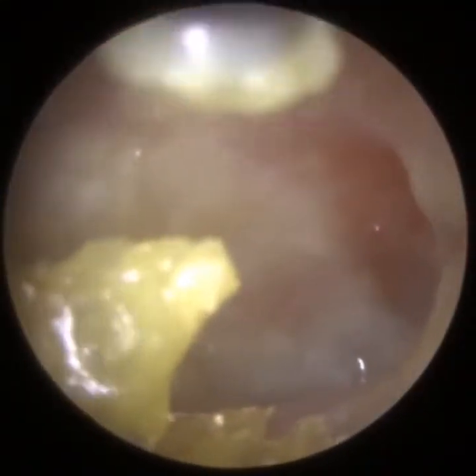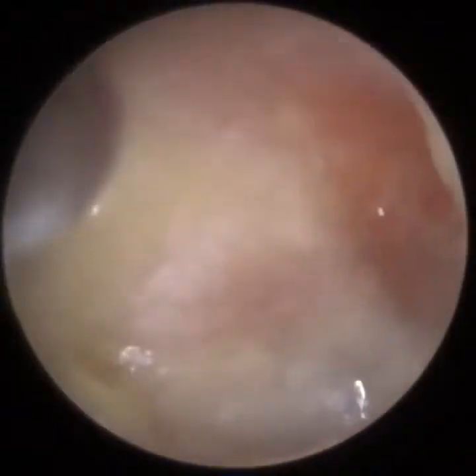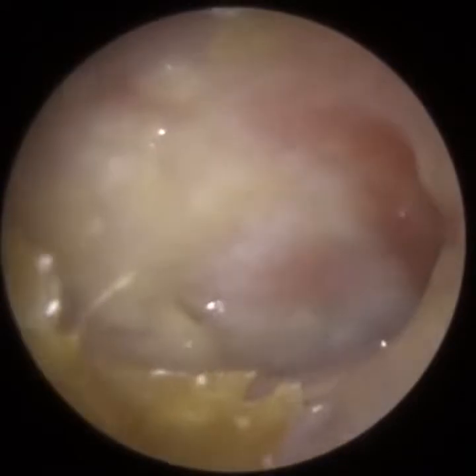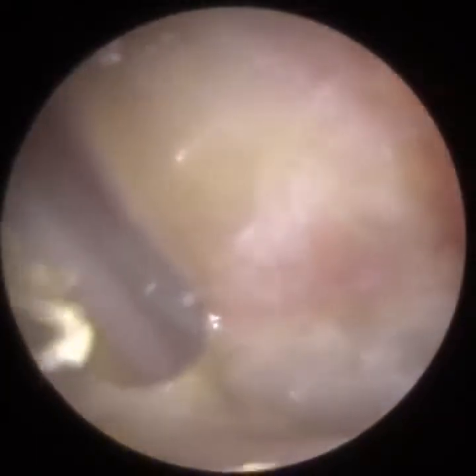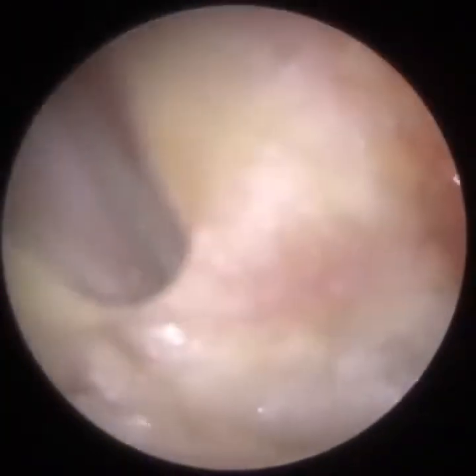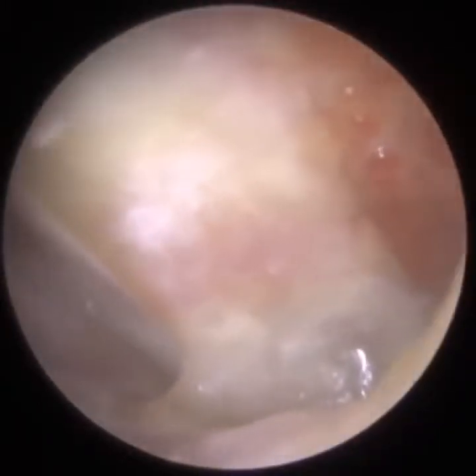So this is more damp, dead skin on the anterior canal wall. It's quite medial, but I was peeling it away more laterally. The umbo, the centre part of the hammer bone, is now visible. The hammer bone is the first bone in the middle ear. You can see it there in the middle of the screen. It's almost like the bullseye of the eardrum. To the right, you've got the granulation tissue. I'm just in the anterior recess here.